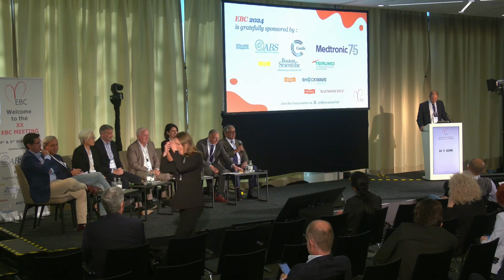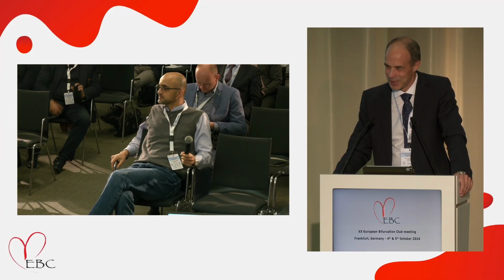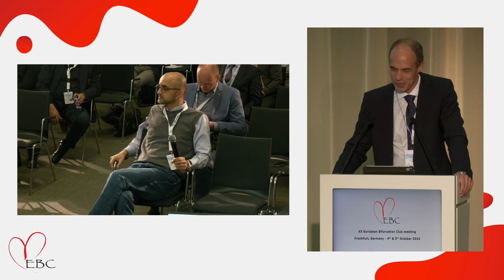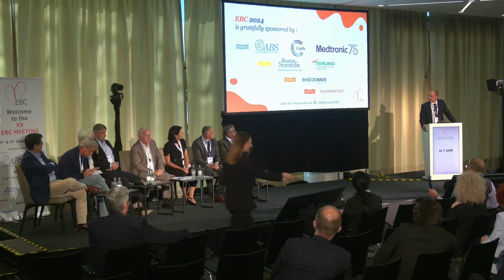Thank you very much for the nice data. My question is about malapposition. In which side of the bifurcation, which level of the bifurcation, was the malapposition observed in the reverse TAP technique, and how do you explain that? Yeah, I have no explanation because we only saw it at 6 months and not before, and it was at the carina. So was the carina covered in your initial index procedure by imaging? You did OCT in both branches, right? Yeah, and the carina was covered. It was apposed. So there are no gaps left, basically. There were no gaps left.